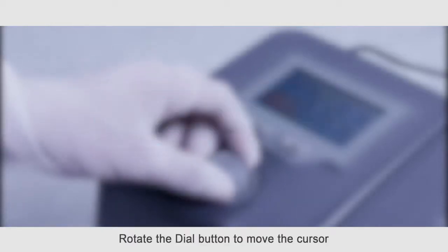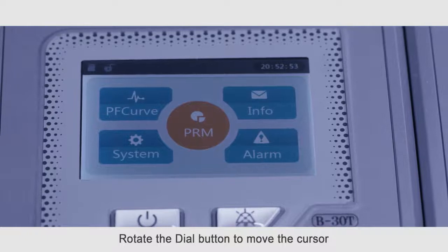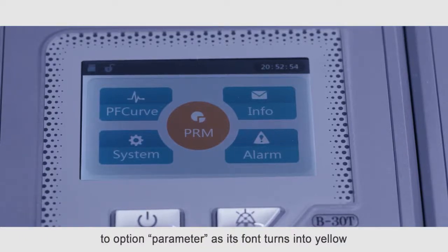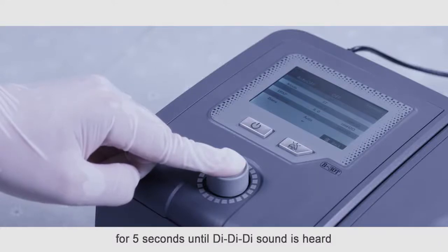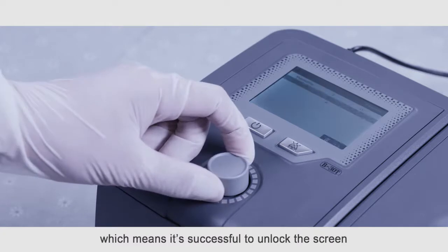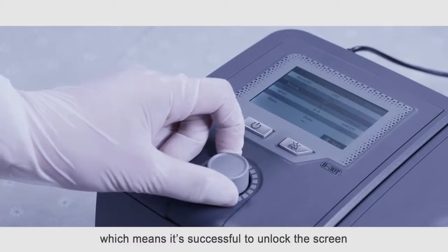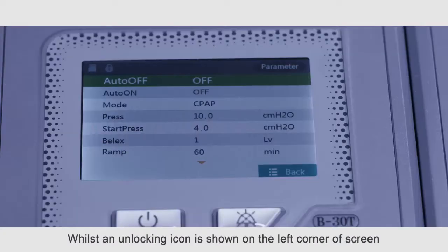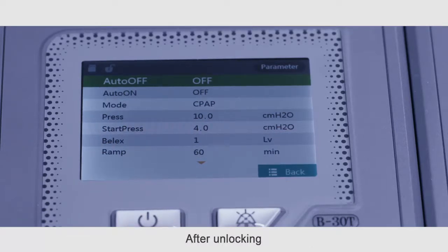Rotate the dial button to move the cursor to option parameter as its front turns into yellow. And then press and hold on the dial button for five seconds until DDD sound is heard, which means it's successful to unlock the screen. An unlocking icon is shown on the left corner of screen.